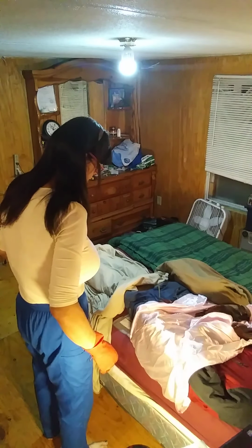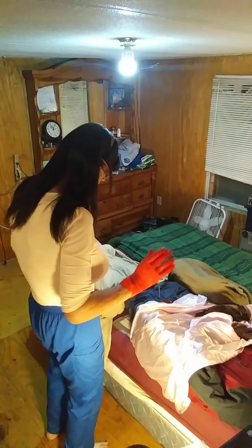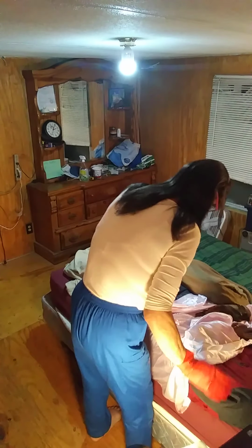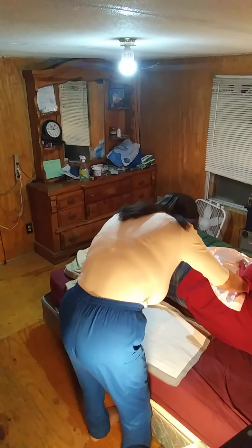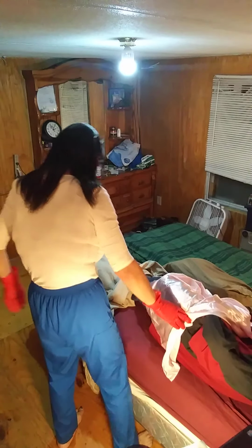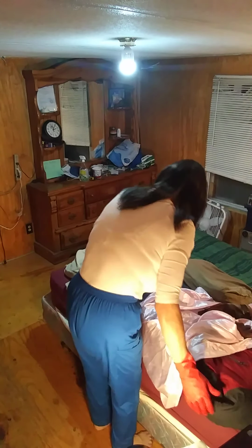Okay. What I'm going to do now is roll Miss Cheswick back on her side, and I'm going to take the linen protector out. Okay, Miss Cheswick, I'm going to roll you back over again on 3. Ready? 1, 2, 3. Roll. Okay, I support her, and I get the linen protector out. I roll the linen protector, dirty side in, and I throw that right in my trash. I roll her back over, carefully.